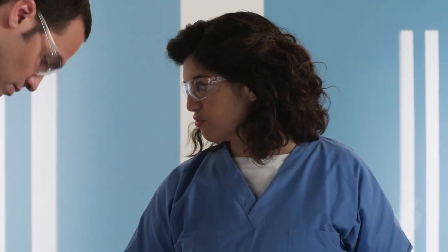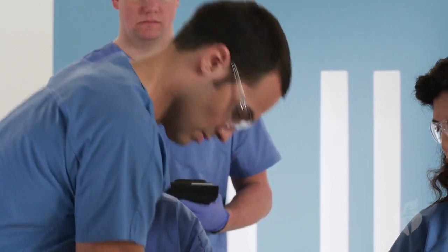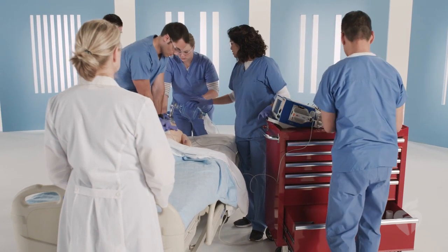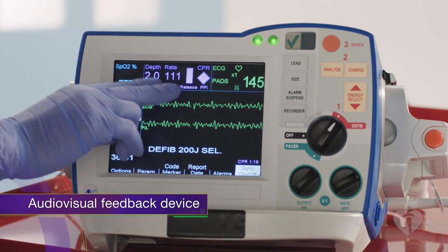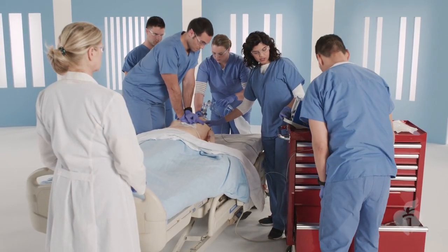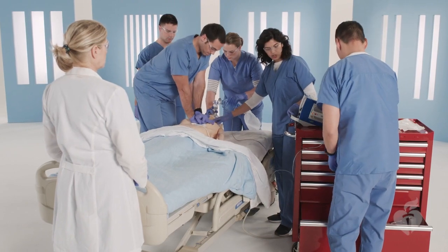The presence of a CPR coach allows the team leader to focus on other elements of cardiac arrest care. Whether you're a basic life support provider or an advanced life support provider, the role of CPR coach exists to help you and your team deliver high-quality CPR. The most effective way to implement the role of a CPR coach is with a real-time audio-visual feedback device. We'll discuss some of the functions of the CPR coach and how they use feedback devices.